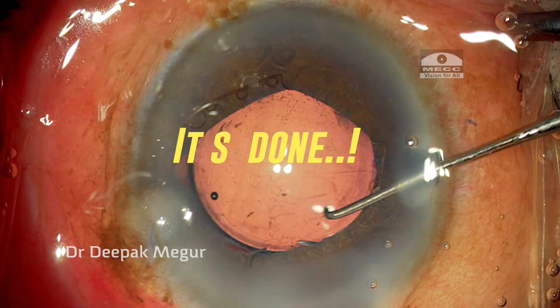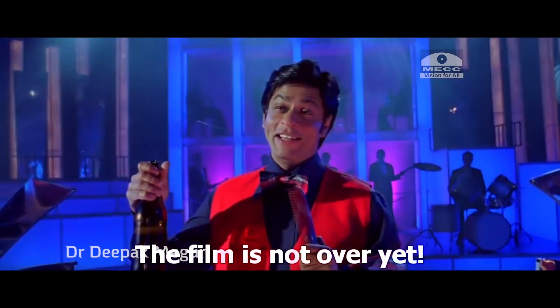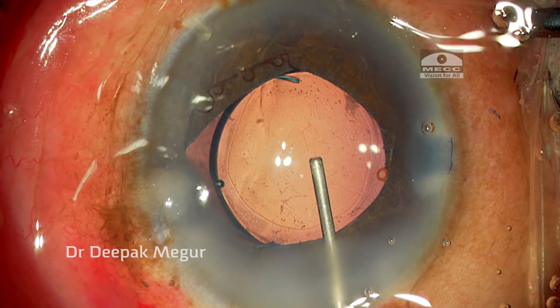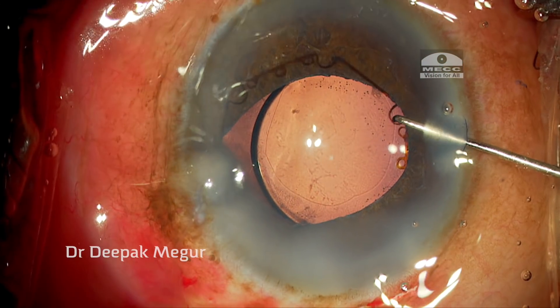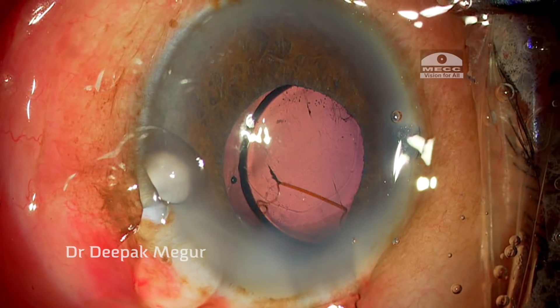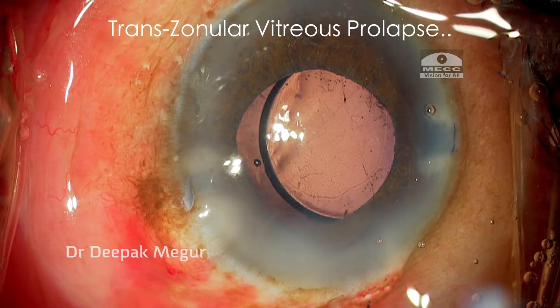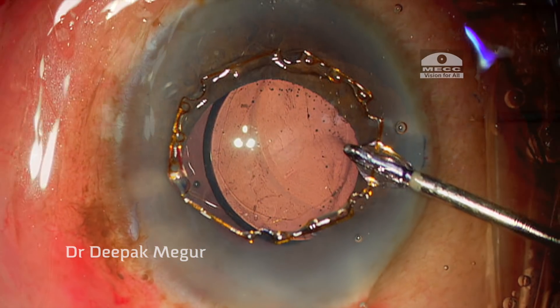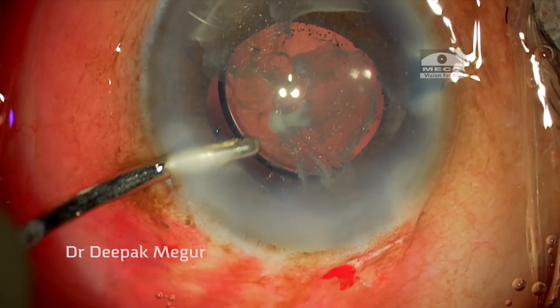At this moment I thought the job was done, but little did I realize it was far from over. I still need to remove the B-hex ring. As I disengage the notches from the pupillary margin and try to remove it, I can see that something is wrong — a vitreous band is entangled and has probably prolapsed through the transzonular region, so I need to cut it. I realize that an additional step has to be done. I use diluted triamcinolone acetonide to stain the vitreous.